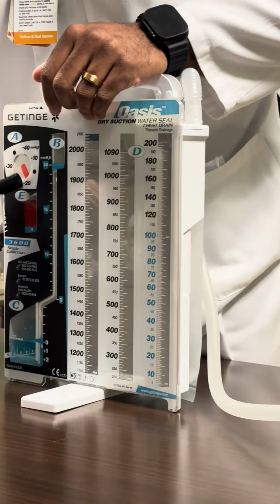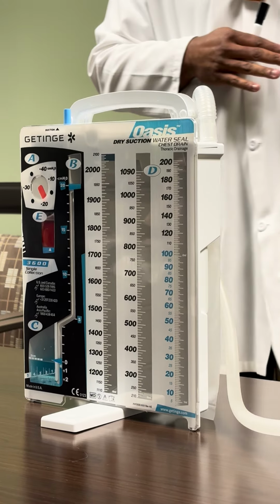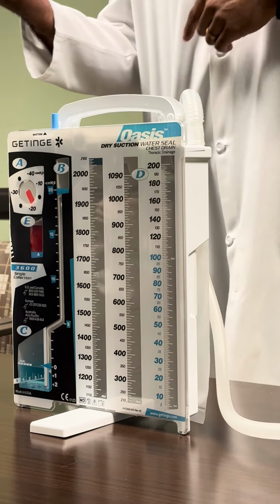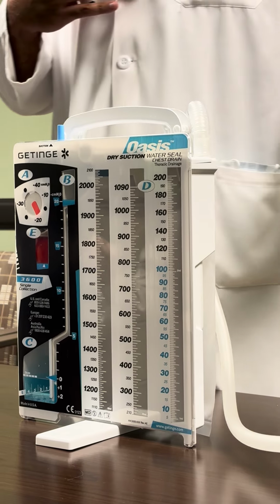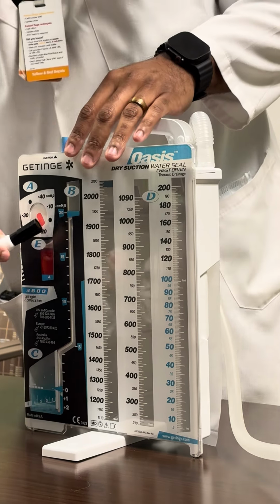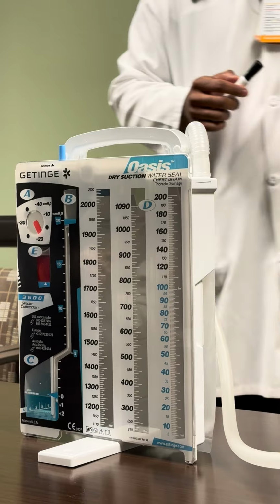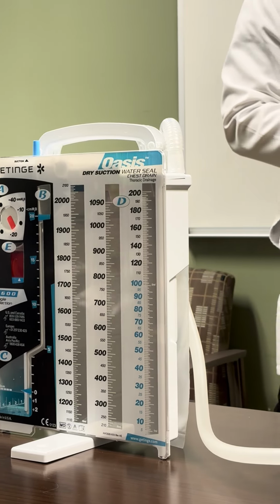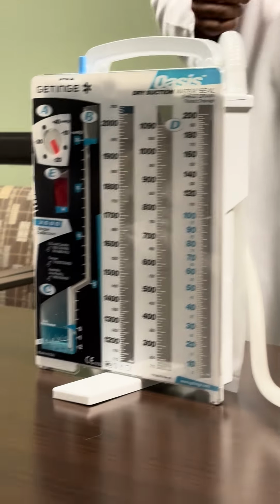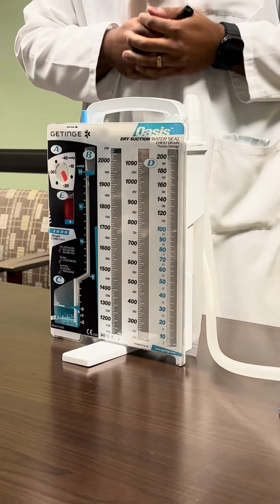And then again, I want you to note where we're at in terms of our suction. Note your orders in Epic, okay? So on our end, we should be doing a good job accurately placing orders in terms of where we need to be in terms of our suction. Do we need to be continuous wall suction, 20, 30, 40? By the way, when you're placing the patient to wall suction, never place the patient on intermittent wall suction. Place the patient on continuous wall suction. Always should be continuous wall suction.